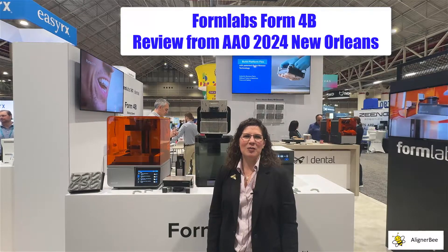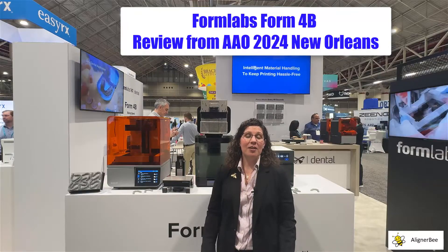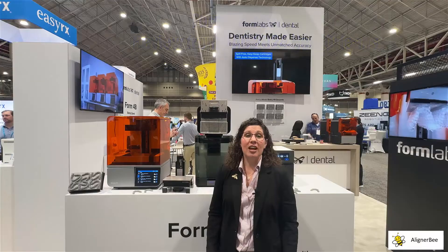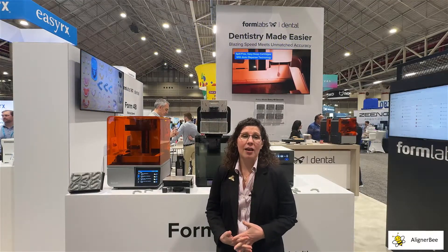Hi, this is Dr. Melissa Chotel, also known as the Aligner Bee, and I'm here today at the American Association of Orthodontists meeting in New Orleans. I wanted to check out the new 3D printer that was just released by Formlabs.